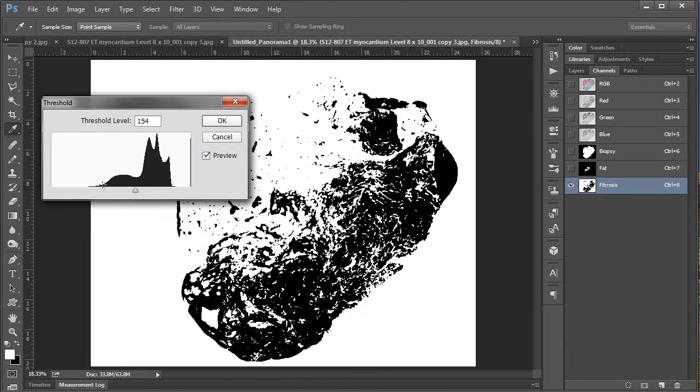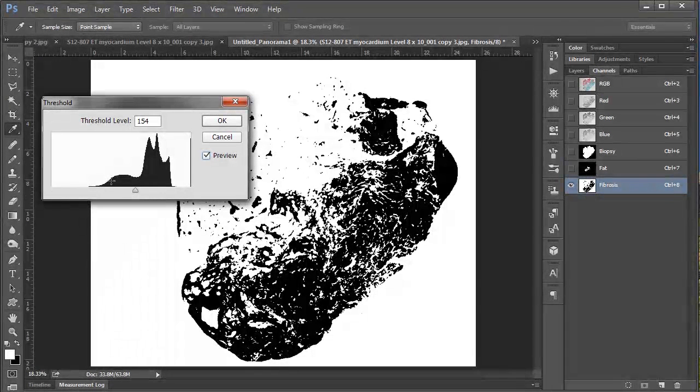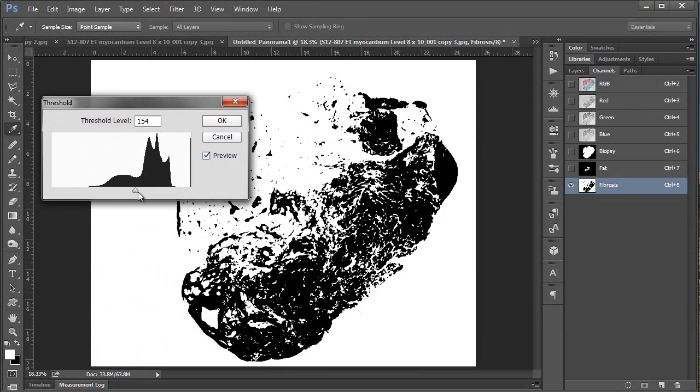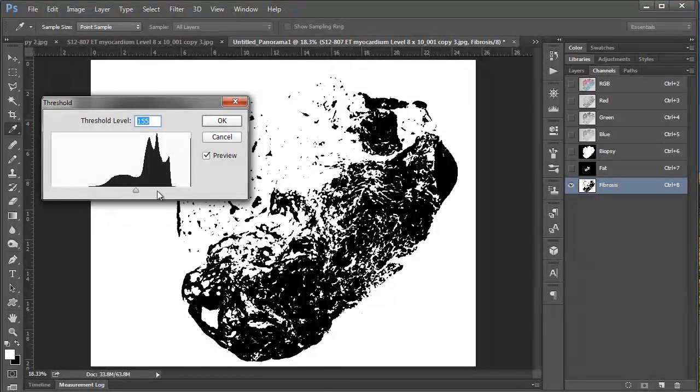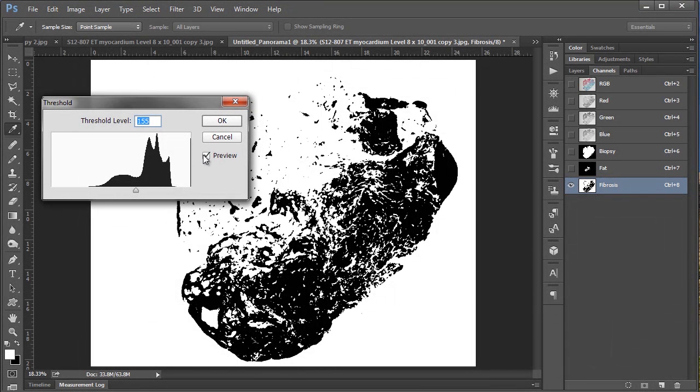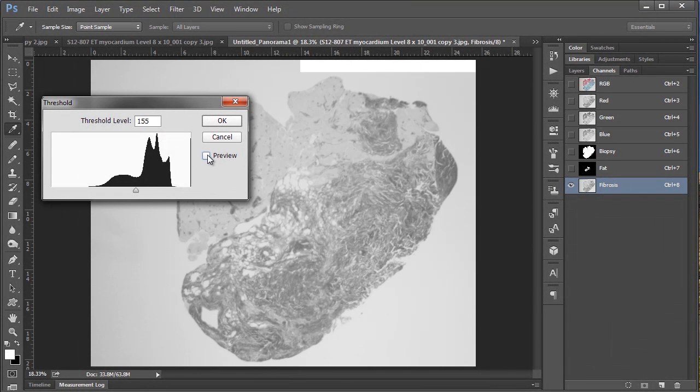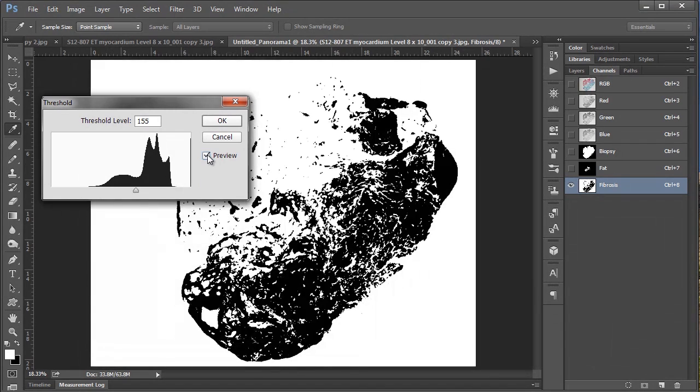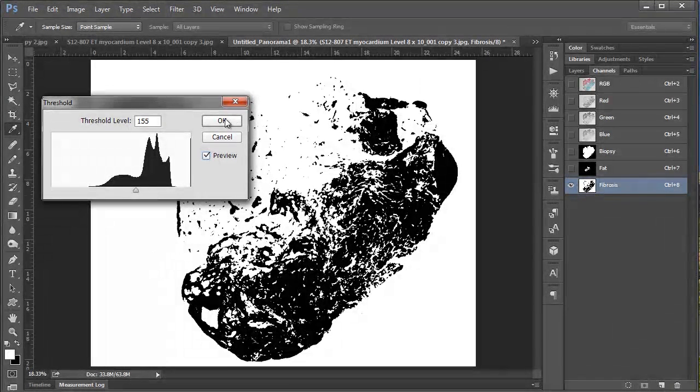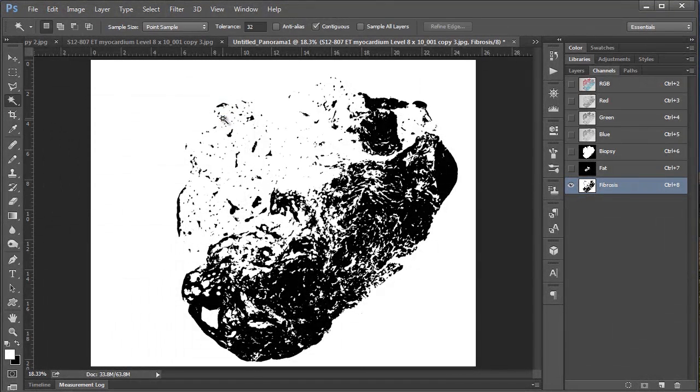And to me I can tell sort of by this hump that that's kind of the information that we're after. So I think as long as I'm in kind of this little valley I'll have what I'm after, which again looking at the preview it looks pretty good. So I'm going to say okay.